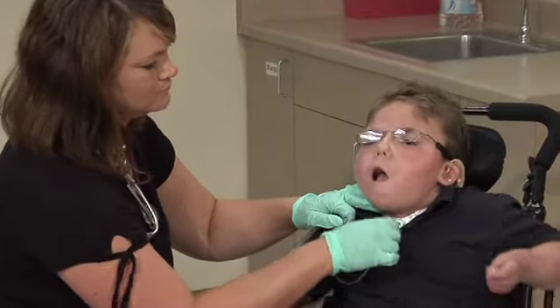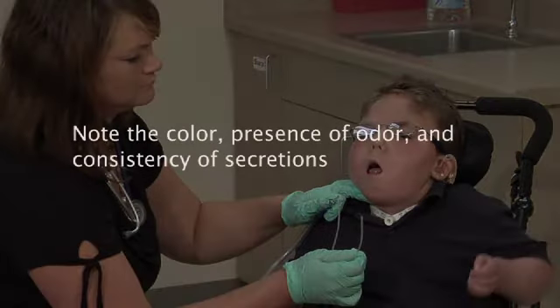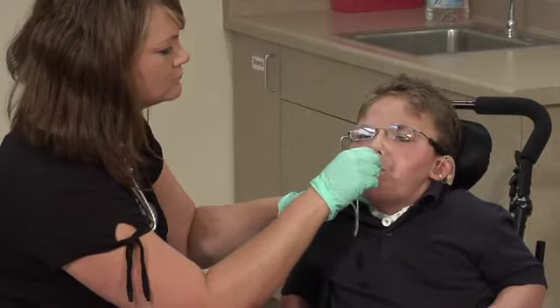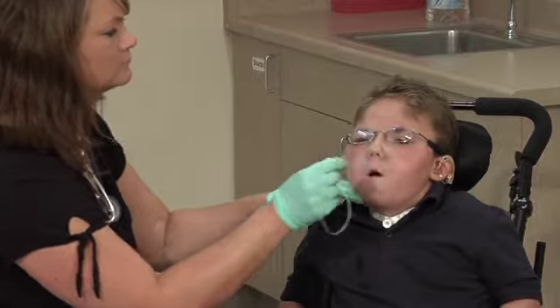Repeat the suctioning until secretions are removed. Be sure to note the color, the presence of odor, and the consistency of the secretions. If you will be discarding the catheter after use, suction the nose and or mouth with the same catheter in the same way.